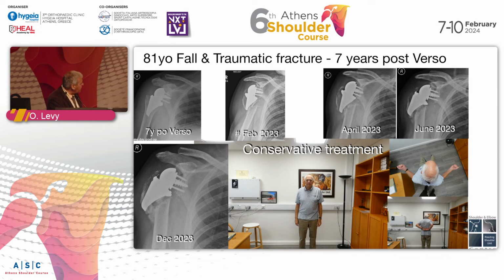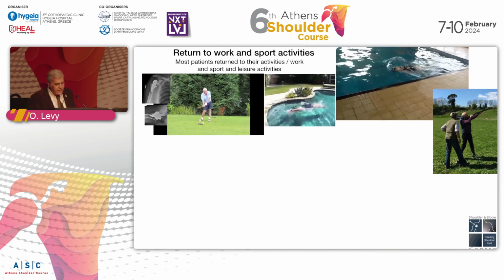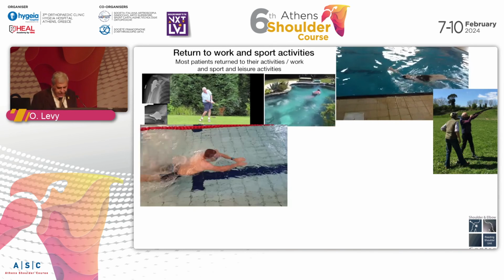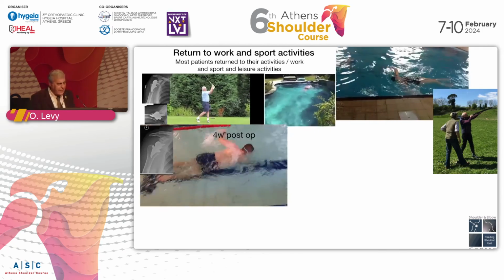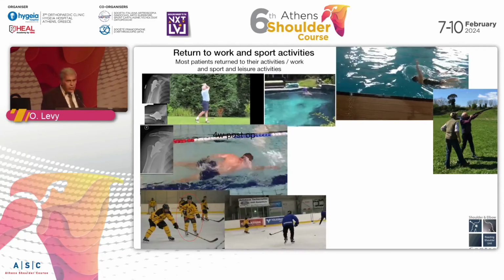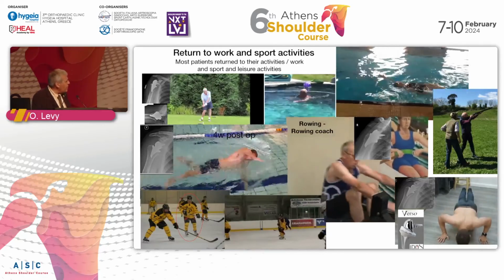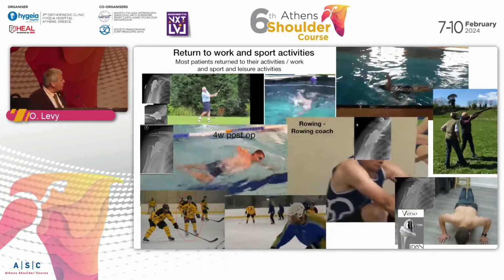You can see that the bone actually filled around the implant, although it's not optimal, but he's got good function and he's happy. Patients are returning to all sports, all activities. I don't actually limit them. And even crazy stuff like ice hockey or rowing, and you can see they do different things.